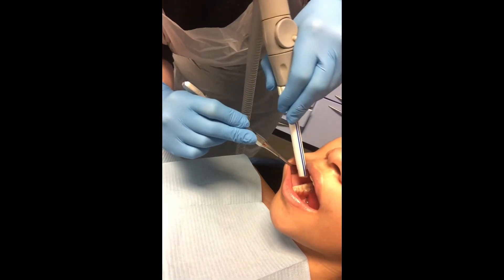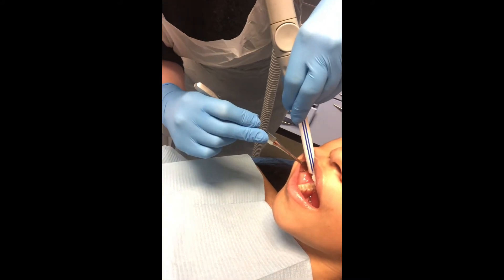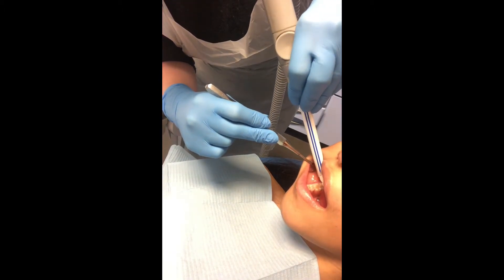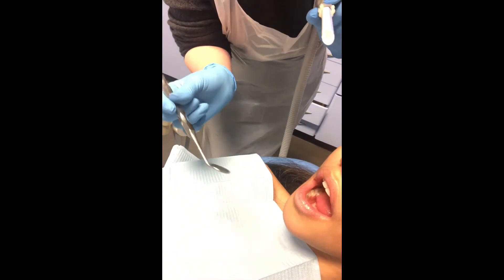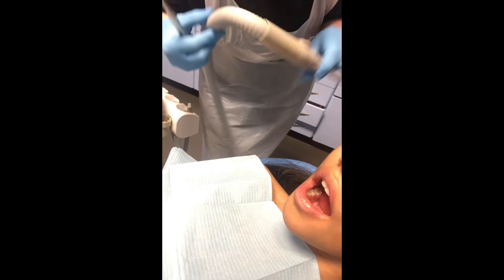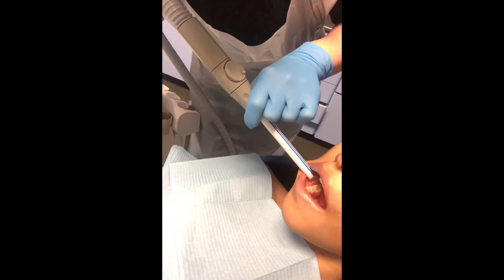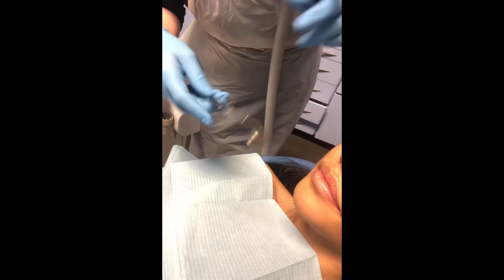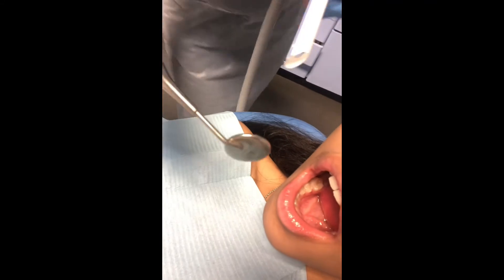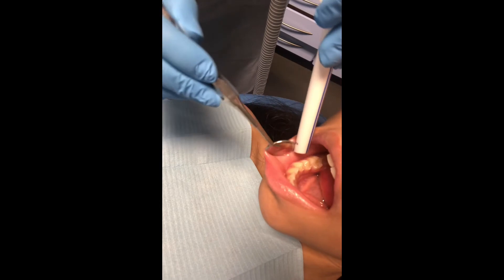Go in with your aspirator. If the dentist is drilling from this side, you give him a clear vision to see. You can hold the aspirator and you can turn the aspirator as well. You might not need to use the mirror — in that case you can still hold it and hold the cable so it doesn't bend. So you can go in there and just aspirate like this, moving around the soft tissues.